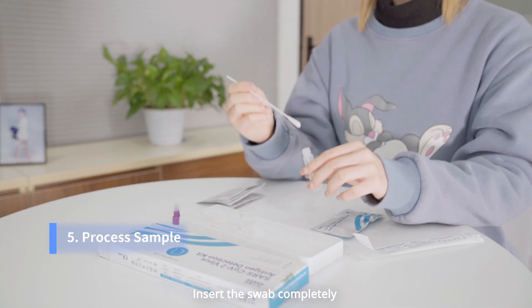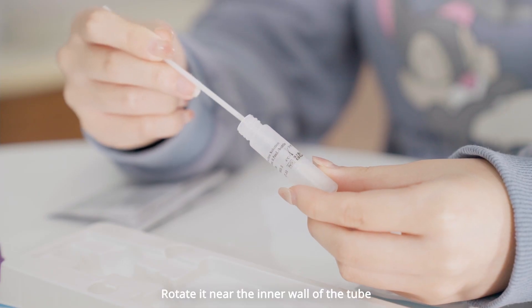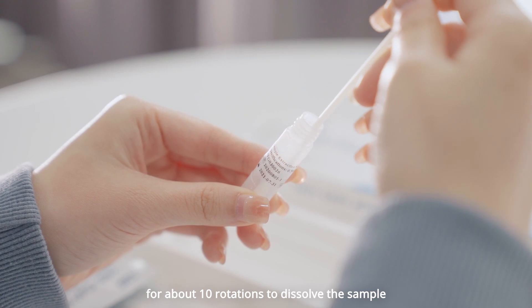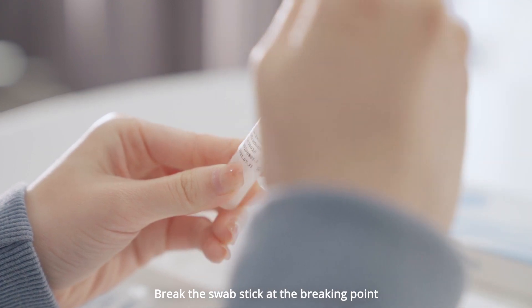Insert the swab completely into the sample extraction solution. Rotate it near the inner wall of the tube for about 10 rotations to dissolve the sample.